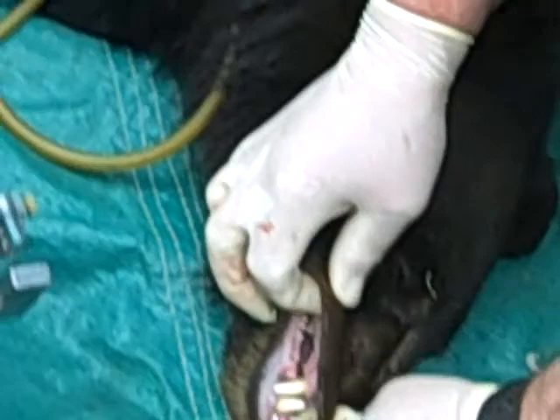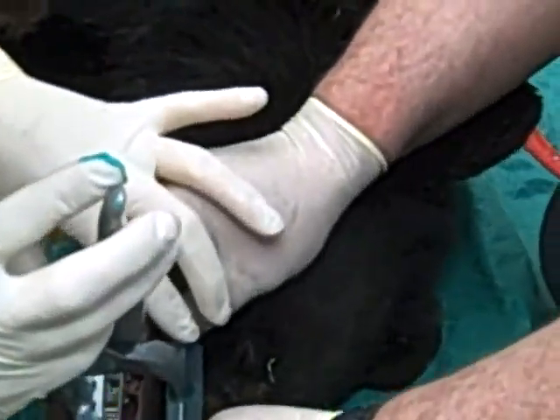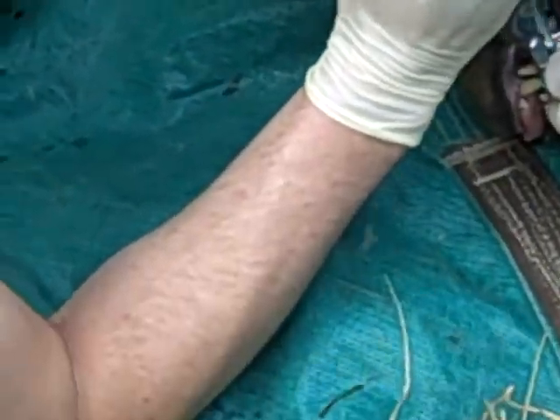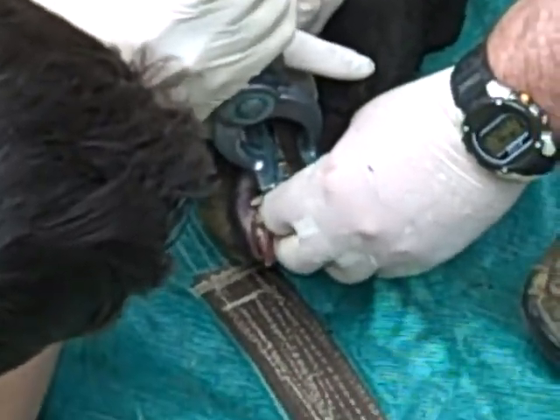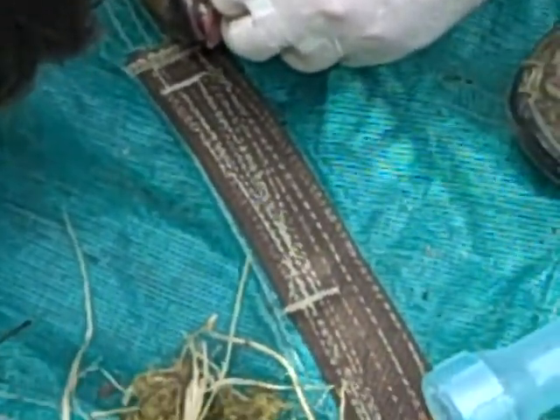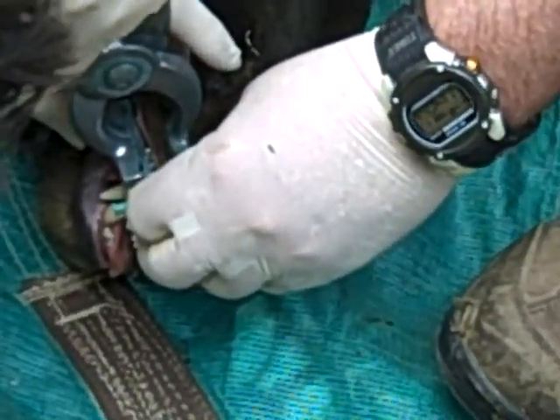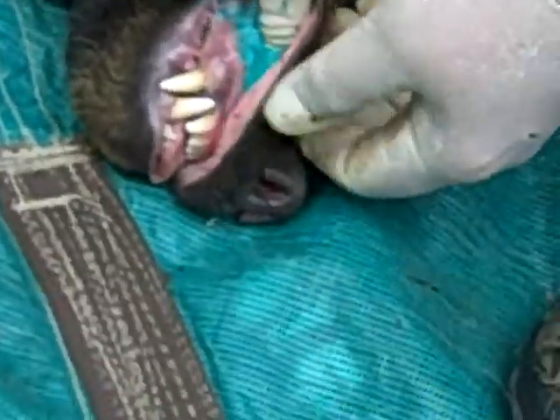Okay, you grab that. Position them on the smooth part. Give it a squeeze. You'll kind of feel it go in through the skin. Give it a squeeze. Hold it a sec. Pull it out. When you pull it out, see if you can see the marks in the skin. Oh, perfect. Oh, that's a good one.